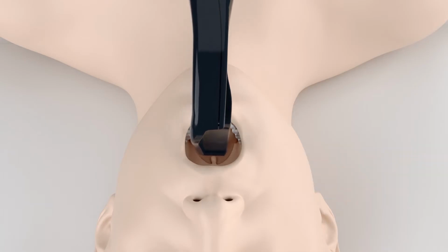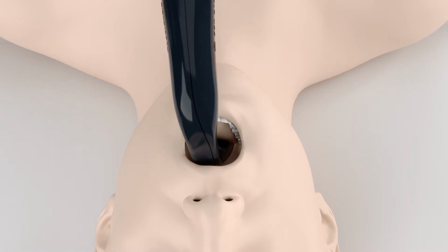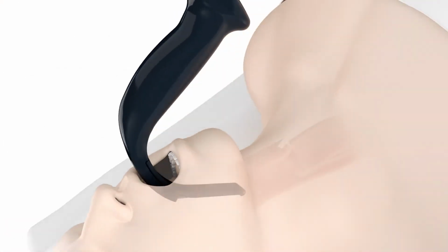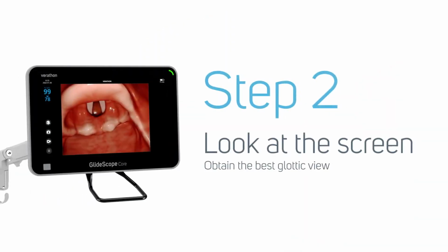Gently advance the laryngoscope along the curvature of the tongue until the tip of the blade is past the posterior portion of the tongue and into the oropharynx. Step 2 is performed while viewing the video monitor the entire time.